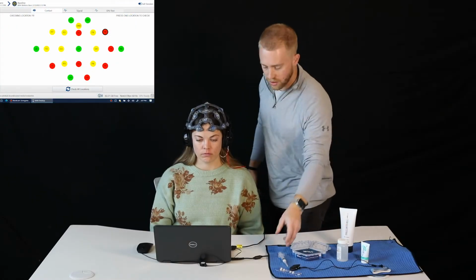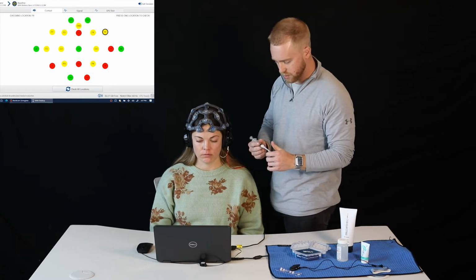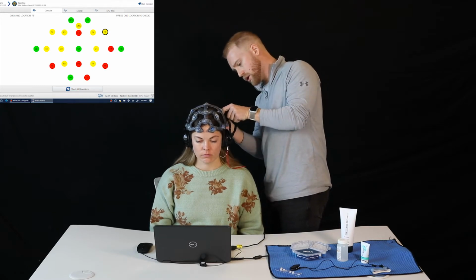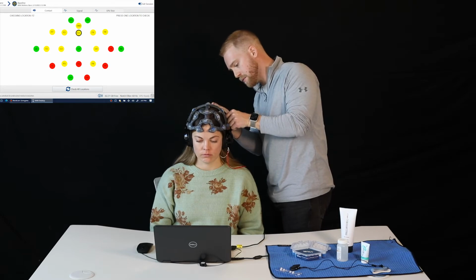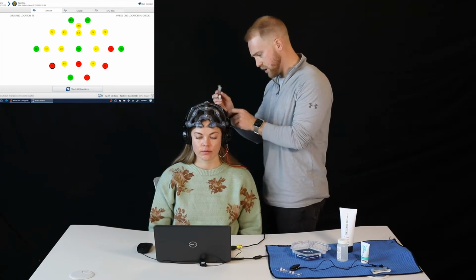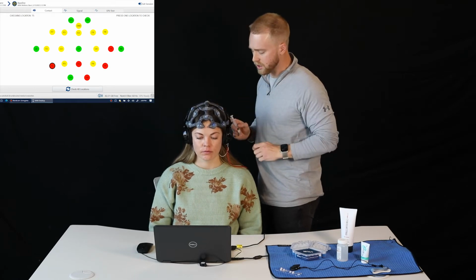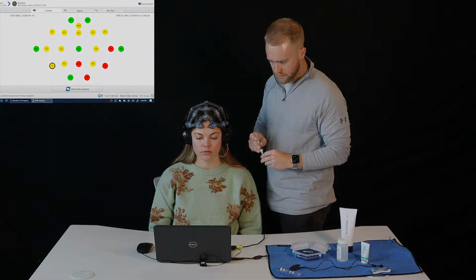A couple things we encourage you to do if you're having some trouble with the sites is to take some of the Paul Mitchell that we've provided you, and you can apply just a little bit underneath the site, and this should help clear up some of the noise and give us a little bit cleaner connection. Another thing you can do with the blunt needle that we provide you is use it to help get some of the hair out of the way. Just be careful not to poke their scalp, but it's pretty useful in getting some of the hair out of the way and helping clean up the connection.